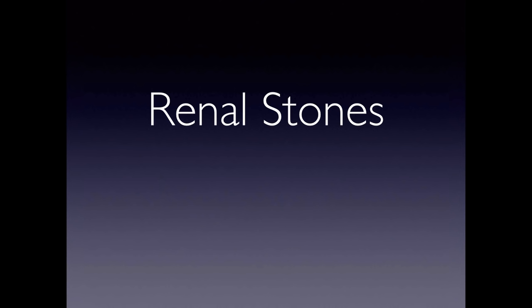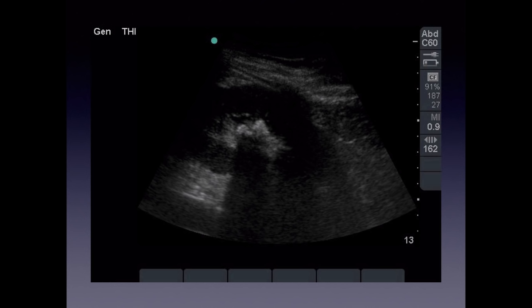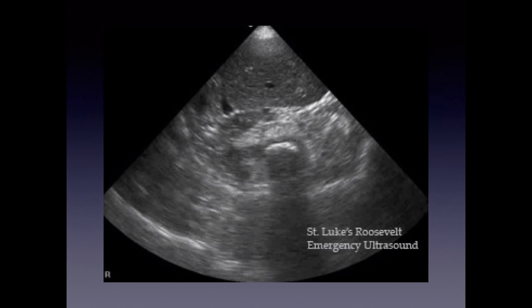Renal stones can be seen in the kidney on ultrasound. We usually cannot follow the ureter all the way down to visualize stones there, except in the proximal ureter or the very distal ureter adjacent to the bladder. Renal stones appear hyperechoic with a posterior clean shadow — well-demarcated — as opposed to the dirty shadow seen with bowel. This is because calcium or bone does not conduct ultrasound waves, causing complete blockage and a clean shadow behind.